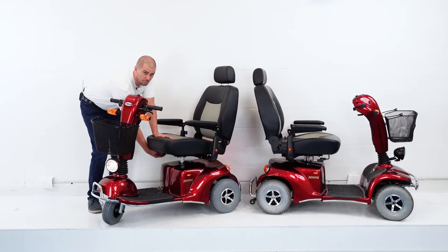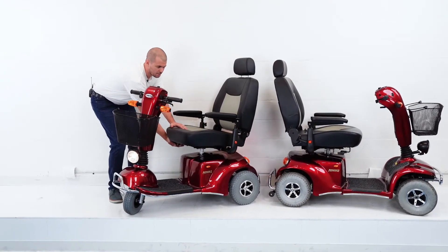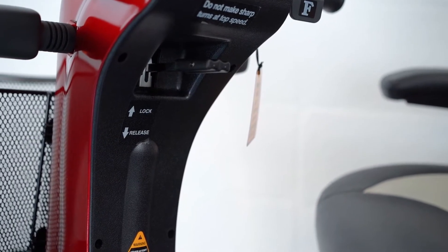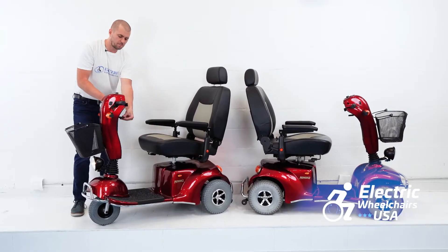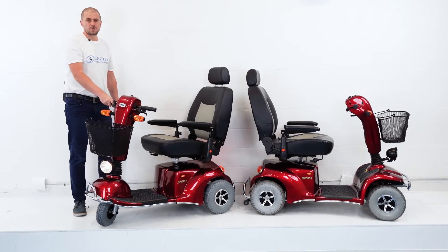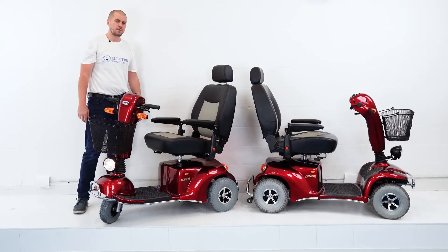If you need to scoot the seat forward or backward, there's another lever you just pull to the side. The tiller also has a hydraulic lever so you can pull it away from you or towards you, whatever you need to find the best comfortable position for your body. All of these features are available on the four-wheel model as well.